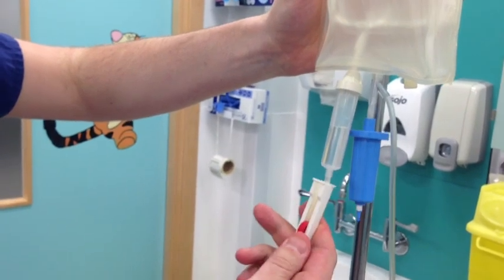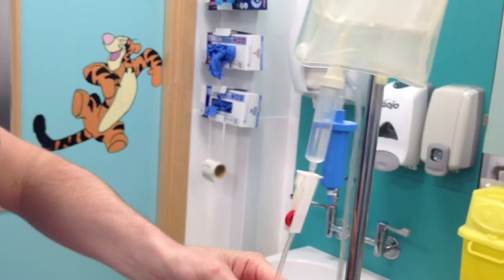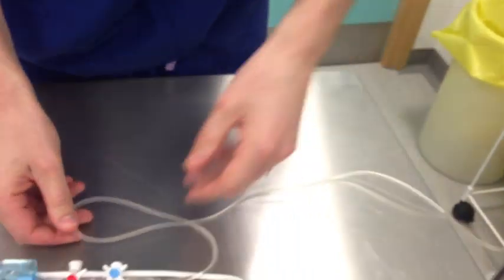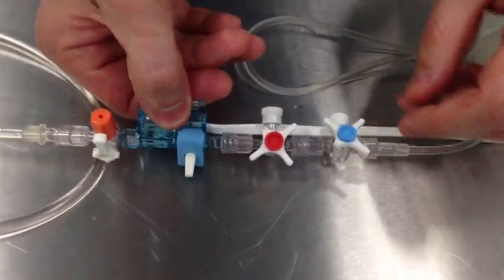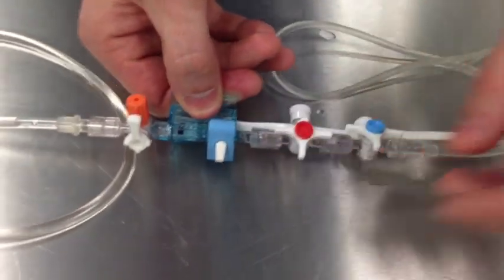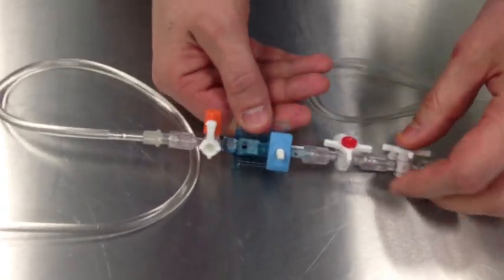It is turned off at the stopcock, which would clearly hamper readings as well. Following the line down, the tubing is OK down to the transducer; however, there are multiple three-way taps which would interfere. They are obviously turned off as well, which would give no reading at all, and they are also loose, which would interfere with the reading.